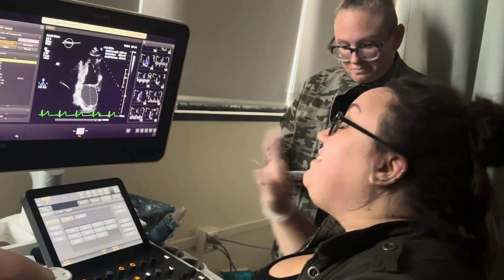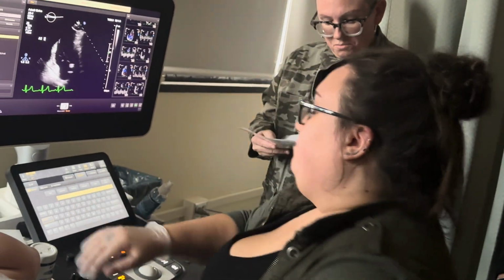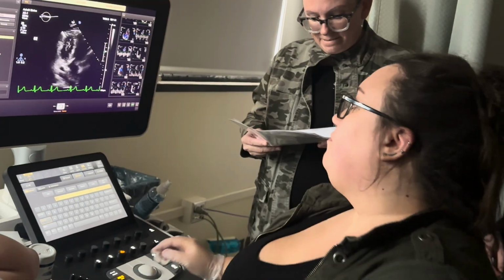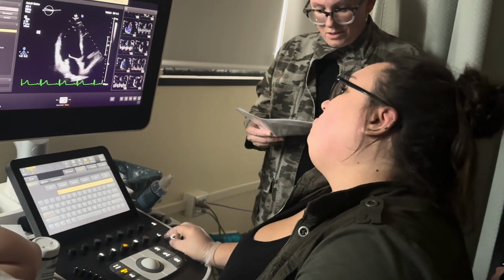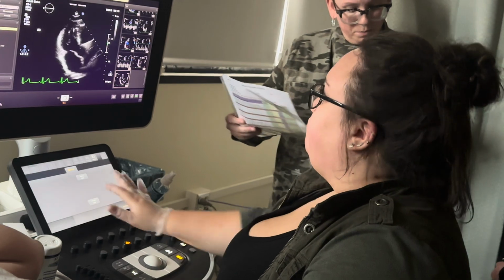Is this it for 2-chamber? That's it, as long as you did your pulse wave and continuous wave. I did. Now you move on to apical 3, and 2-chambers, the one that's true inferior and true anterior. You're gonna do color, and then you're gonna do continuous wave over the mitral valve and aortic valve. Measure anything? Nope.